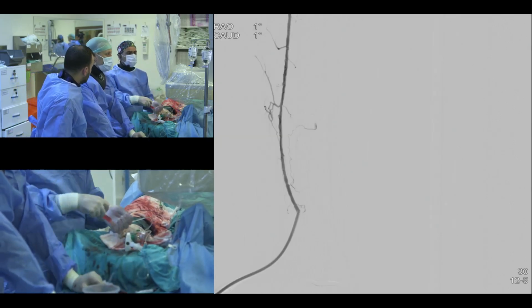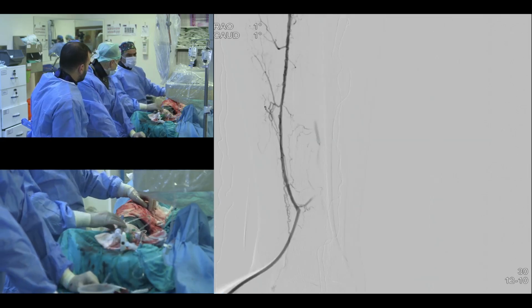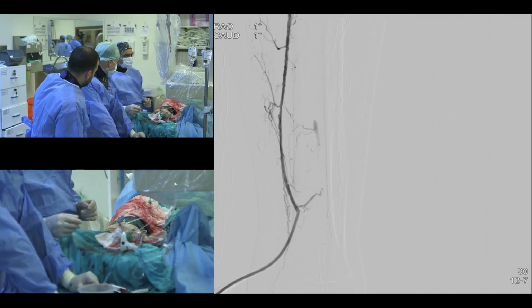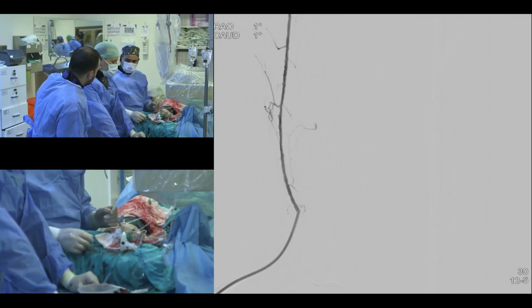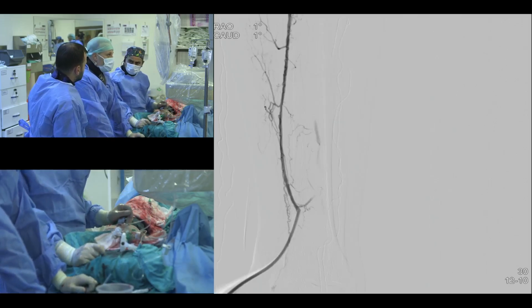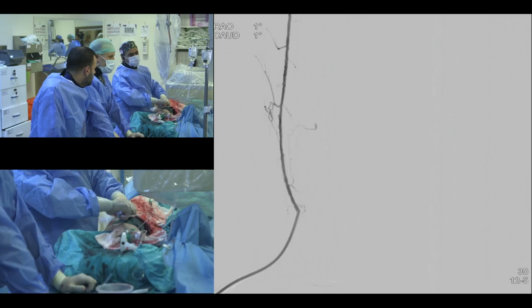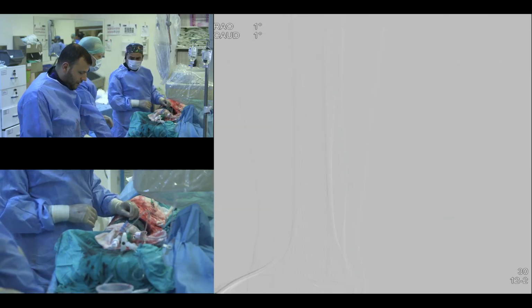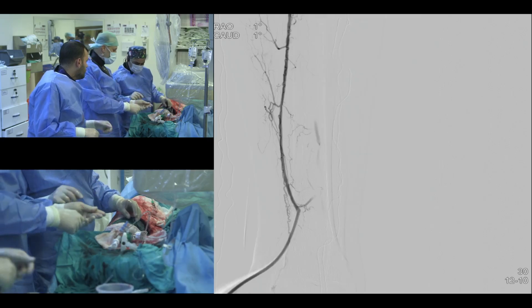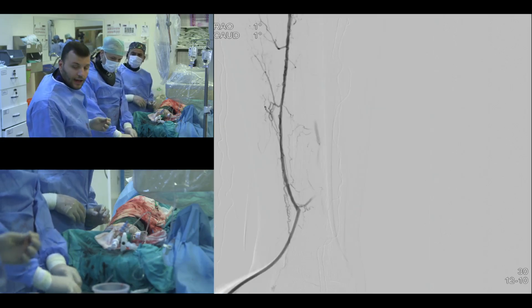Pedal access, I think cardiologists feel very comfortable because of radial access. They can stick the anterior tibial, posterior tibial. I personally don't stick the peroneal, but there are people who do. Whenever you cross a 100% occlusion, put a small catheter, pull out the wire, inject distally, half and half contrast and saline, and make sure you're intraluminal. If you are not intraluminal, no harm done. You can pull out, rewire, and get into the true lumen. Dilate the tract with a 2 millimeter balloon. This is only for occlusion because you need to get your filter device distally.